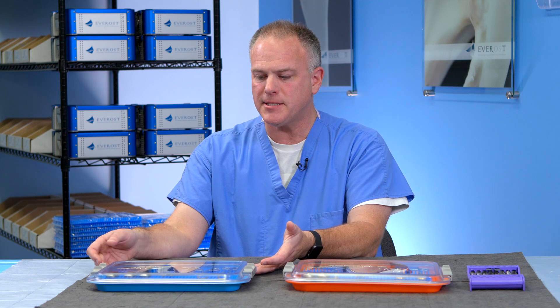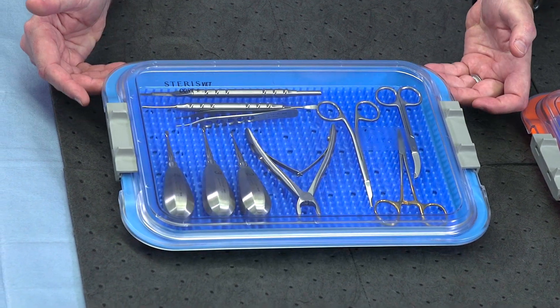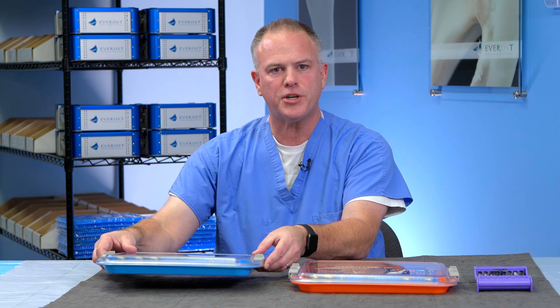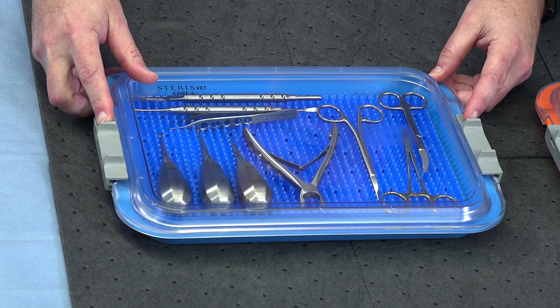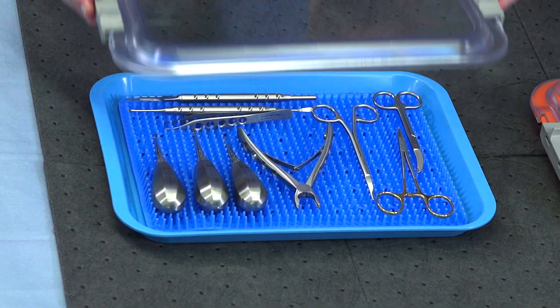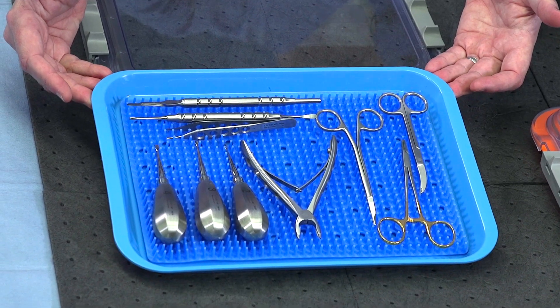The instruments come in a very innovative case. The case has a clear lid which locks down onto the tray. This adds a lot of protection for your valuable instruments. The lid unlocks by sliding the tabs — we can remove the lid here and now there's a procedural tray ready to go.